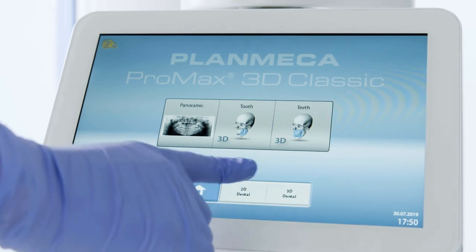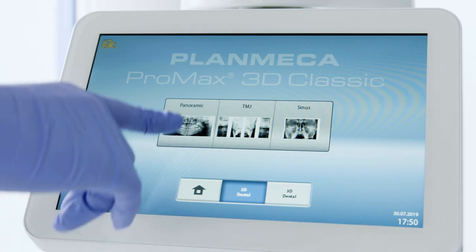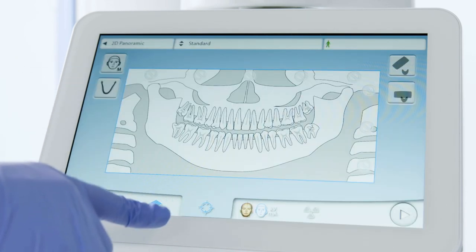Peri-apical setup: To capture a segmented PA-like view, select 2D dental, then panoramic from the touchpad of your Pro Max X-ray unit. To isolate the desired region of interest, select the radiation symbols.